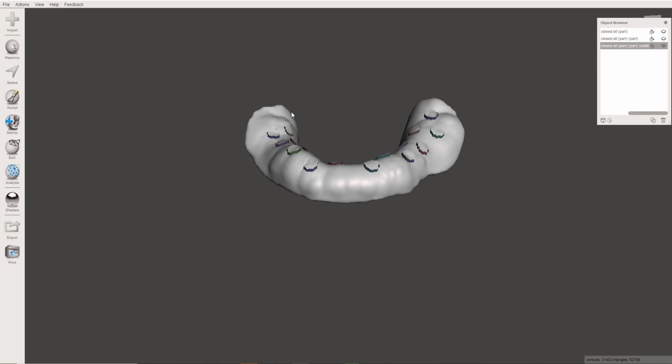So now all you have to do is go and scan that in, and you're ready to go to the final denture, okay? Because you have all your anatomic references, you have your vertical dimension, you've marked midline, and you have VDO. So now all you've got to do is just set the teeth in the software and just go ahead and make the final denture.